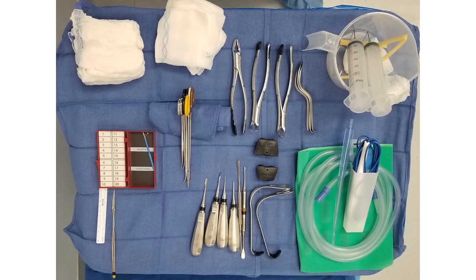That right there is the tip for this electrocautery over here. I like a finer tip, not the finest tip they make, but it's a fine tip for the cautery. Of course, we've got a little ruler back here, and then this is our scalpel handle. That's a number 11 scalpel blade. It's kind of triangular and pointy. Those are not particularly useful for making incisions, but they are useful for poking into an abscess. So when we talk about lancing an abscess, we'll use that.